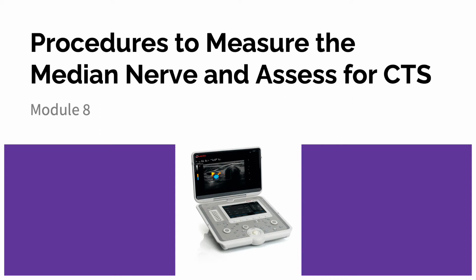This is the 8th and final module. It is going to be about the procedures to measure the median nerve and assess for carpal tunnel syndrome.